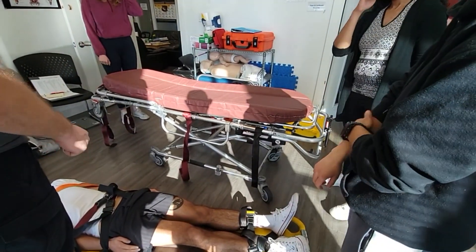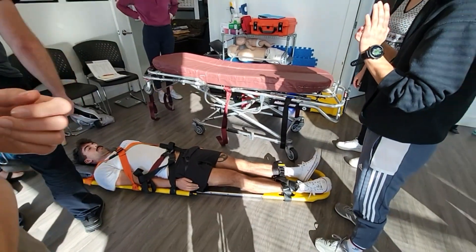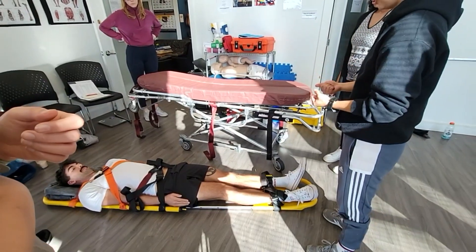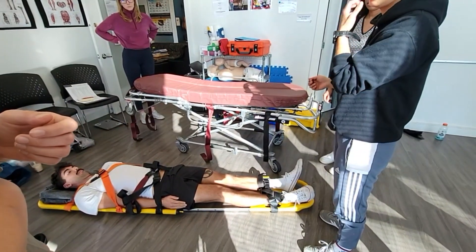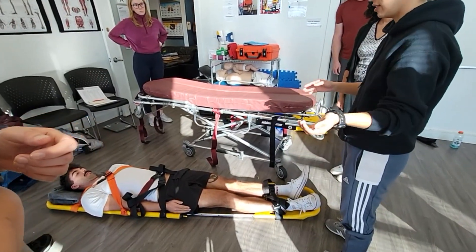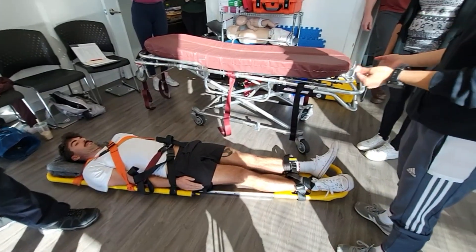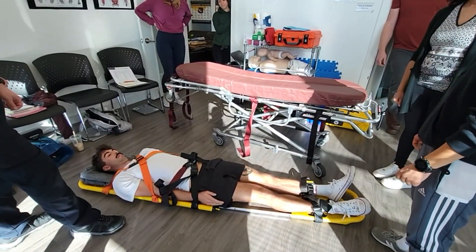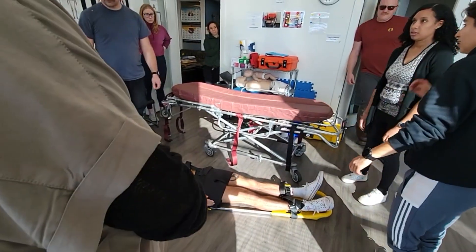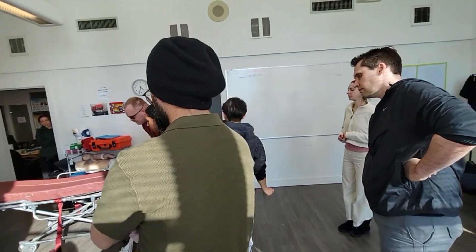What we're going to do is lift the patient onto the stretcher and then show you how to remove the clamshell for a patient that doesn't have to stay on it. If you've picked up an overdose and you've got them on the stretcher, you don't need to leave them on the clamshell because they're not a spinal concern. So let's get four volunteers to lift safely onto the stretcher, making sure it's locked and not going anywhere.